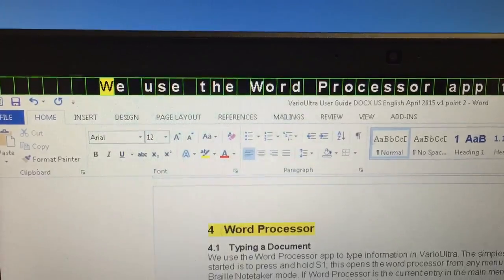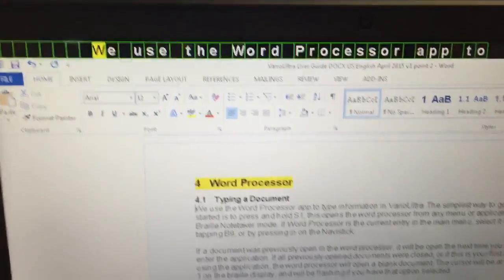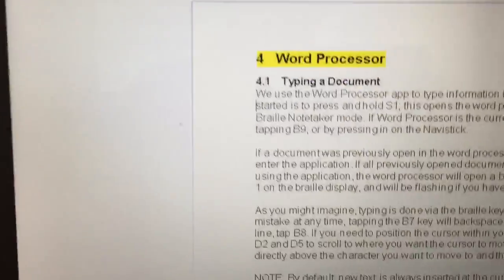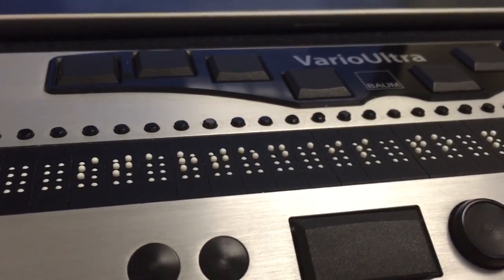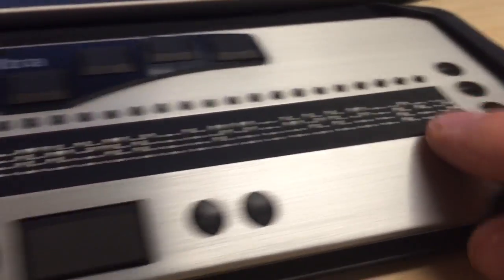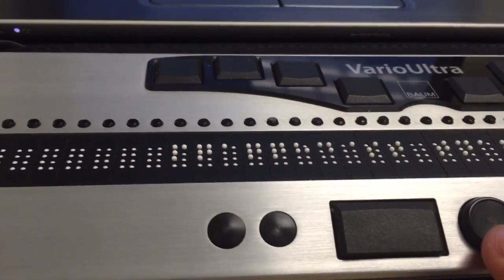We are in non-contracted braille mode right now. If I were to do a chord G using our display buttons, we could display everything in grade two. Right now I can press and hold S1, which opens the word processor from any menu or application. The braille display has also updated to show the content, and we can use either our navigation buttons to move around, or use the NaviStick to move up and down the screen.